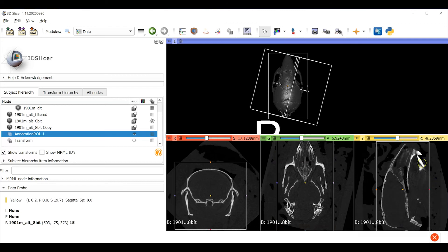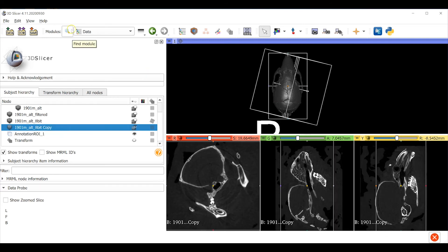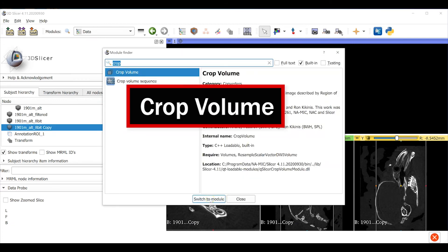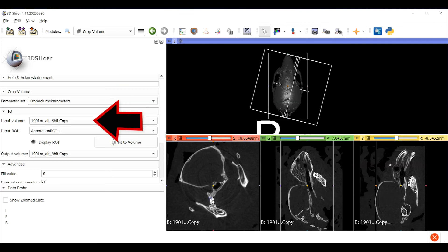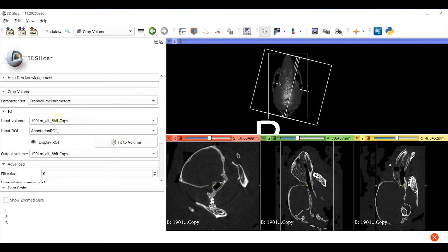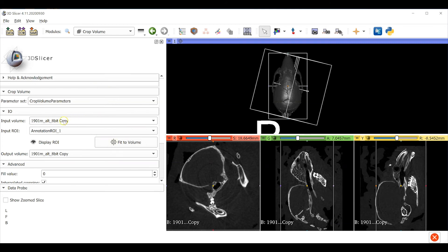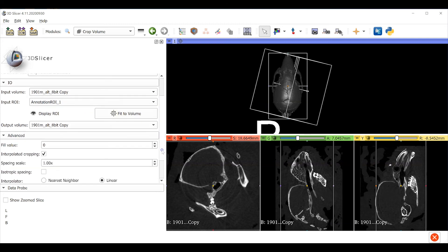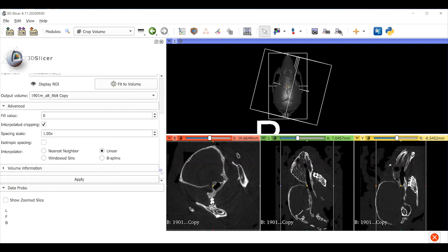Now I'm going to combine this ROI with the copy of the 8-bit volume that we created earlier. This is going to make a template that we're going to use when we re-slice our transformed object. To do this I'm going to go to the magnifying glass icon and search for the crop volume module. For the input volume I'll use the 8-bit copy object that I made back at the beginning of this workflow. This was the original untransformed object and I'll use the ROI that I just created as the input ROI. I'm going to leave 8-bit copy as the output volume. This means that the new template volume I'm making here is going to replace and overwrite the 8-bit copy object. It's okay to leave all these default values and then click apply.